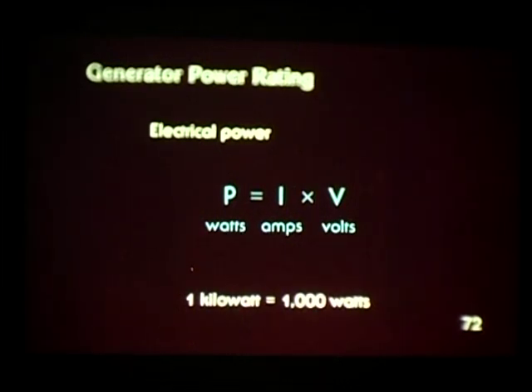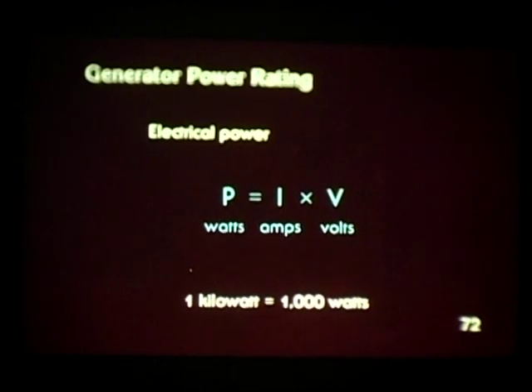X-ray generators are rated according to the amount of power they deliver. Since modern X-ray generators can deliver thousands of watts of power, the maximum power rating of a generator is usually given in terms of kilowatts, 1 kilowatt equaling 1,000 watts.